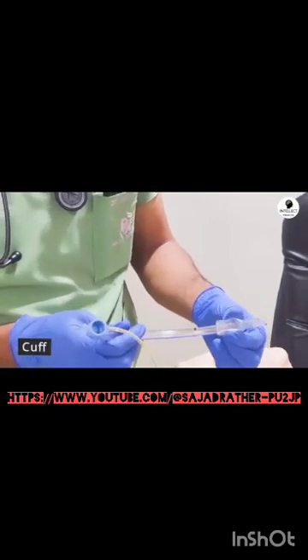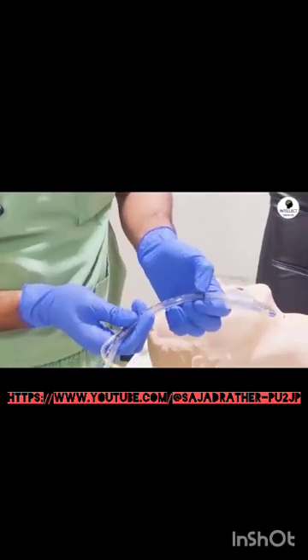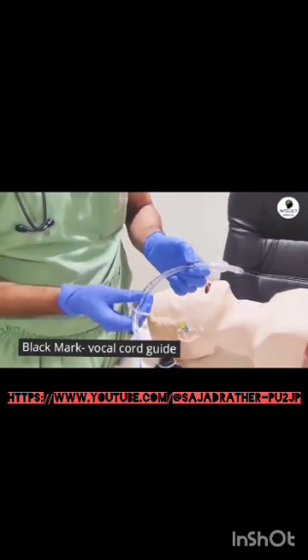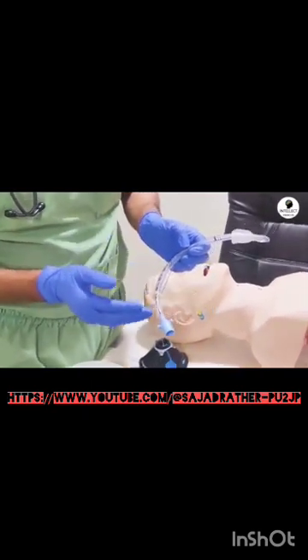This is the cuff of the endotracheal tube. Then there is a mark over here. This black mark should ideally cross the vocal cord while you are intubating a patient. And there are various marks over here so as to see the depth.